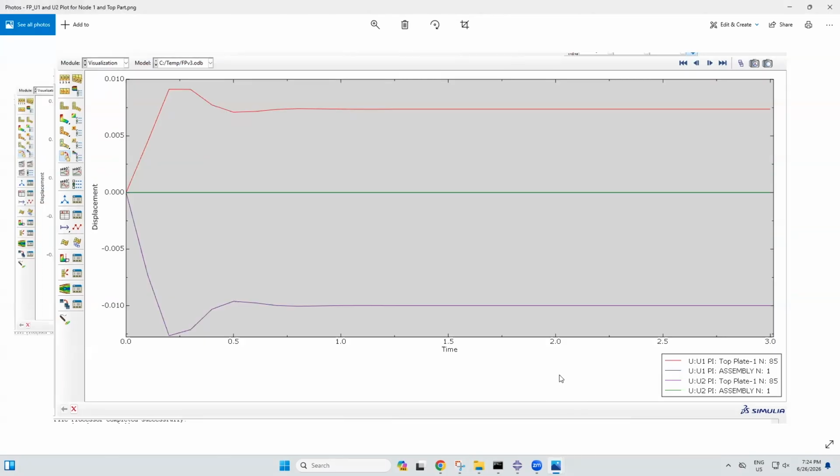For the vertical and horizontal displacements, I selected two nodes, one on the top edge of the top plate and the ground reference point. We can see here that the horizontal displacement, or U1, of the top plate is non-zero. It is positive as the part initially deforms, and then will start to negate as the part starts to reach equilibrium, and here we can see it has reached equilibrium as it levels out. The horizontal displacement of the ground is 0 because we did constrain it in that direction.